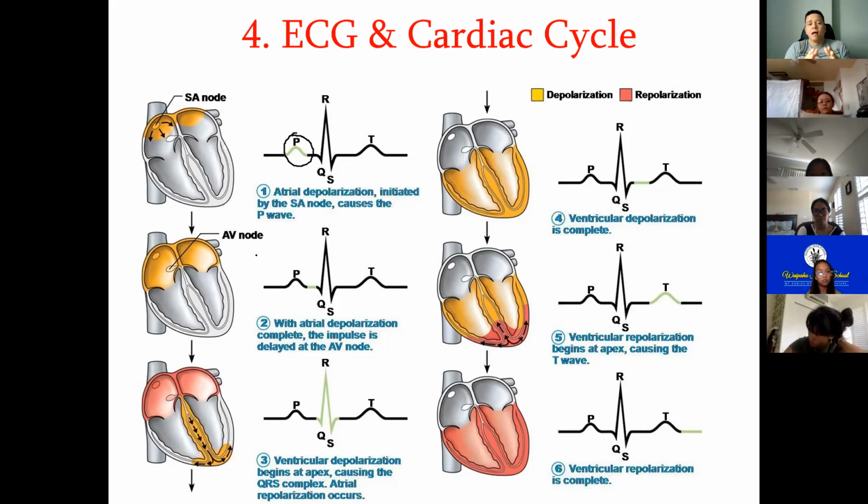All right. An ECG does not measure muscle contraction. It does not measure tension in the cardiac muscle. This happens because of the depolarization and repolarization. But all that the ECG is picking up is that change in the membrane potential.